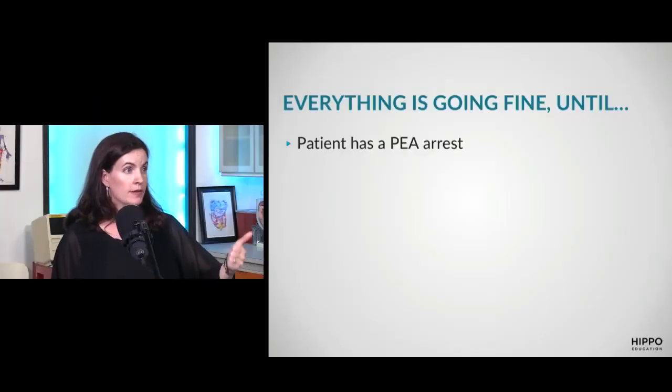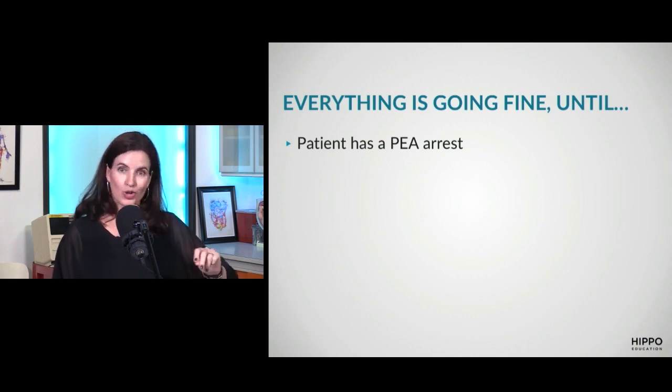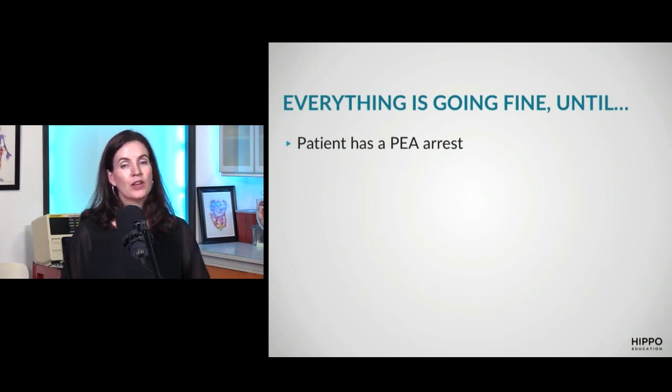And so in general, for these people, I am starting ACLS. I'm checking where the tube is. For any patient who has a cardiac arrest, I will take them off the ventilator. The ventilator is just too difficult for us to manage in terms of our cognitive load during a cardiac arrest. So just manually bag to make it easier for yourself and turn off the vent so it can't alarm all throughout your arrest. And then you want to think through your differential diagnosis for these patients.